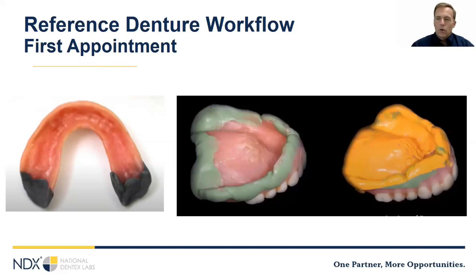As you guys know, paint adhesive first, then syringe your heavy body around the borders. Hold the denture in place with your fingers and ask the patient to open and close while you're holding the denture, move the mandible from side to side, show their biggest Duchenne smile, and then pucker.